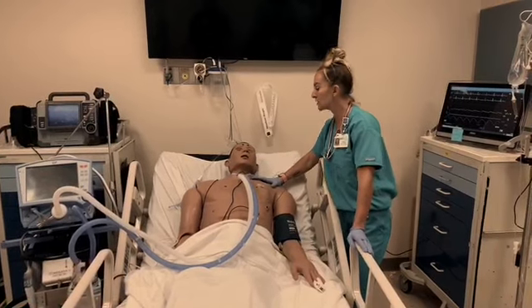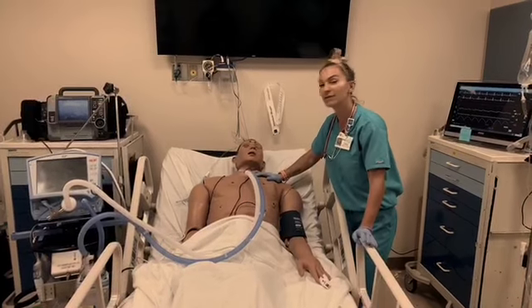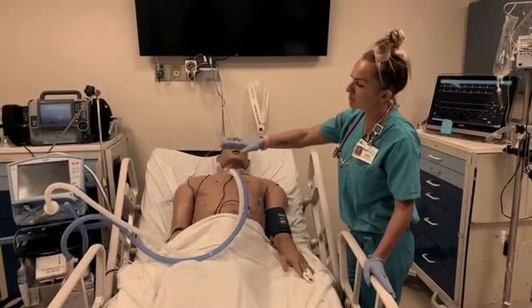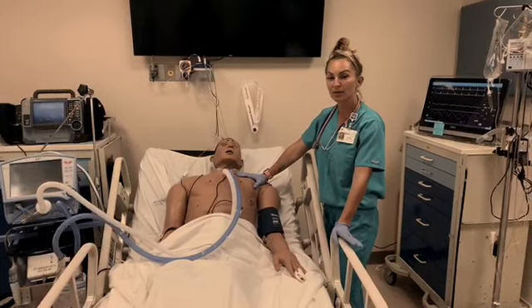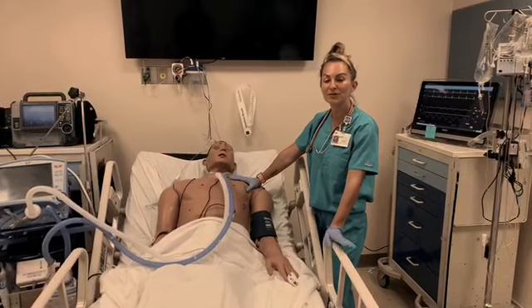Other things you're going to want to look at: is there a lot of increased secretions? Is there a lot of increased bleeding around the trach site or inside the cannula? If the patient is connected to the vent, you want to make sure that their inspiratory, expiratory waves are going up and down, and that they're actually oxygenating well. How do we know that they're oxygenating well? Well, we're going to perform our first set of vital signs.